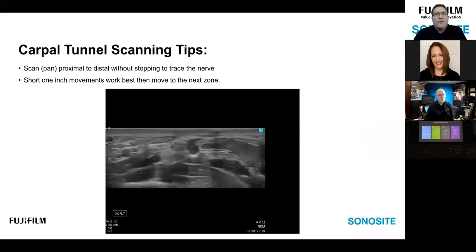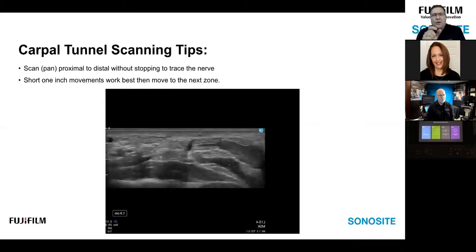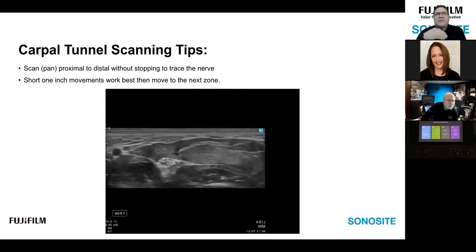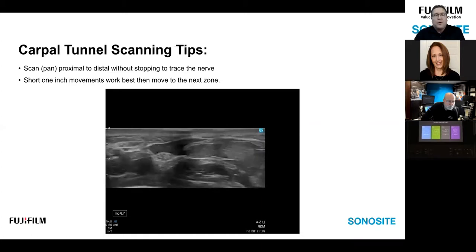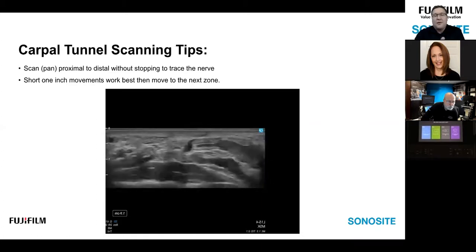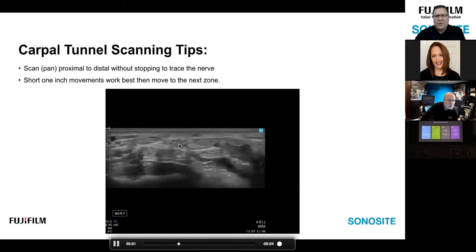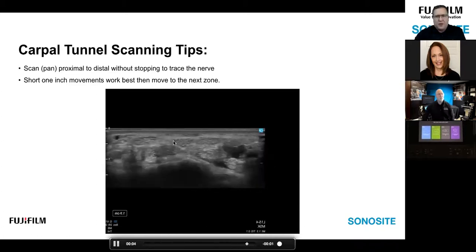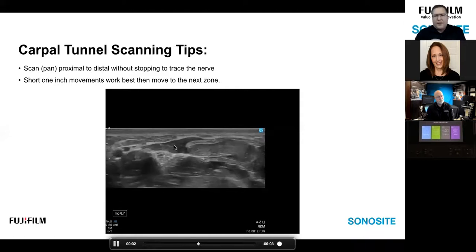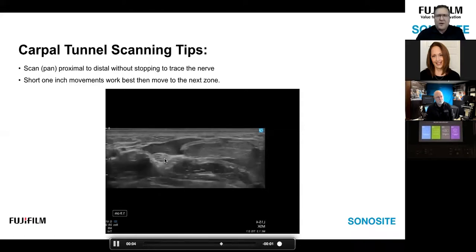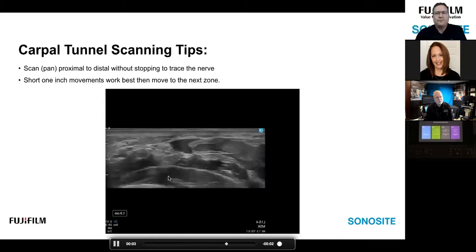When scanning nerves, tendons, or very small nerve branches, scan in little one-inch windows — little proximal-to-distal segments. Don't just set the probe over the area of interest and be still. Make the anatomy move. At the pronator quadratus level, the median nerve rests radial to the flexor tendons, and because this is a zone where tracing the median nerve gets a little hard, as the nerve travels upward you have to match that angle and sweep upward.